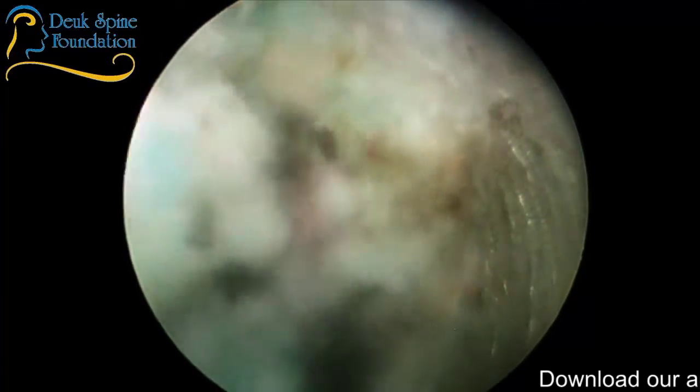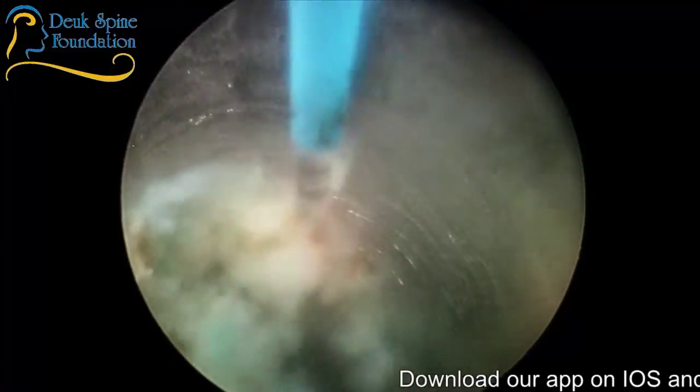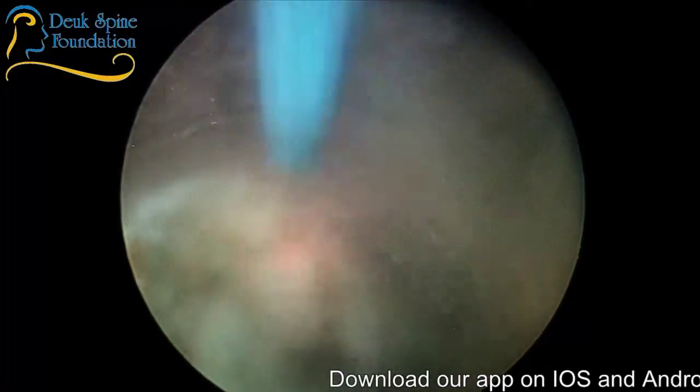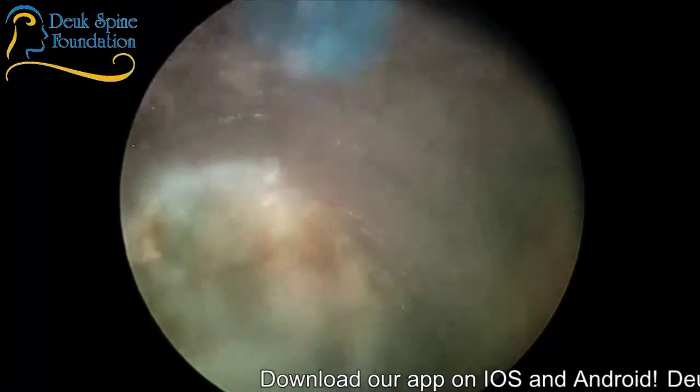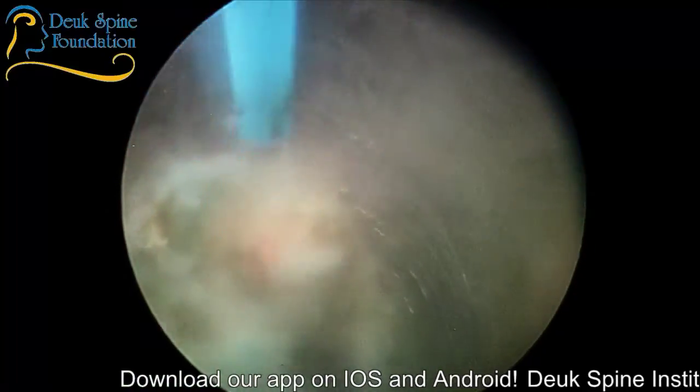How are we doing? Everything good? You're happy? She's not moving at all, so we're good. You can keep her light. How's her blood pressure? Good? Perfect.